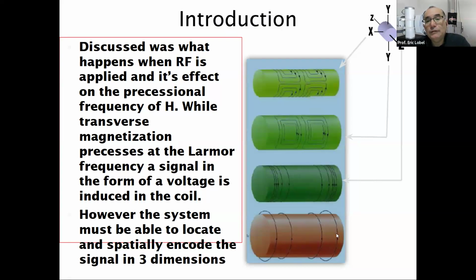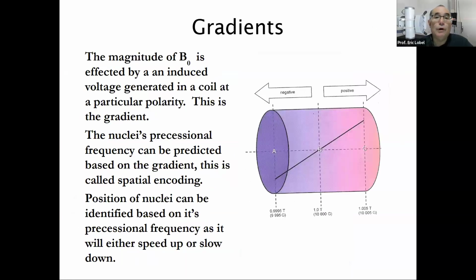What you have over here, I suspect is supposed to be indicative of the main magnetic field, right? That's the big 1 Tesla, 3 Tesla magnet, whatever you purchased from the manufacturer. That's the one most people think about. But the gradients are multitasking supermen, right? They do a lot of work.